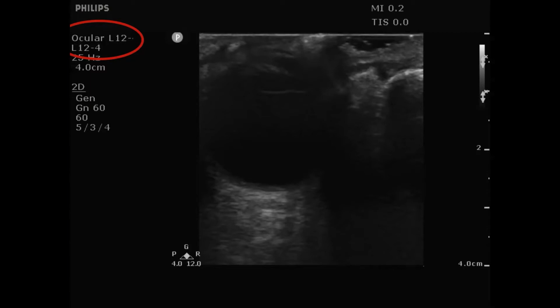And ultrasound is not immune from injecting energy into the body. I mean, without energy, we wouldn't have anything to assess, right? In this context, we're using sound energy. And so while it's safe, we do this on babies because it doesn't cause any perceivable physical harm, right? If we do this for a prolonged period of time, things can happen. We talk about this in the context of the thermal effects of ultrasound, as well as the mechanical or cavitary effects of ultrasound. And so like all other structures, the eye is also sensitive to energy, and probably a little bit more sensitive than things like a kidney or a gallbladder or your heart or lungs. And so we do need to try to honor and respect the ALARA principle and use as minimal energy as possible.